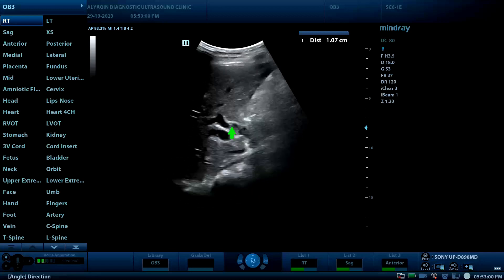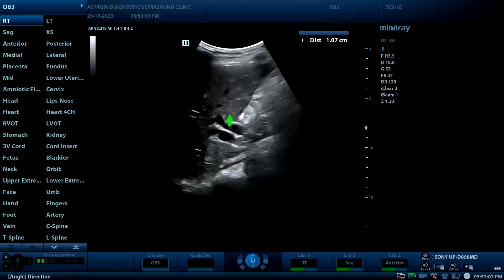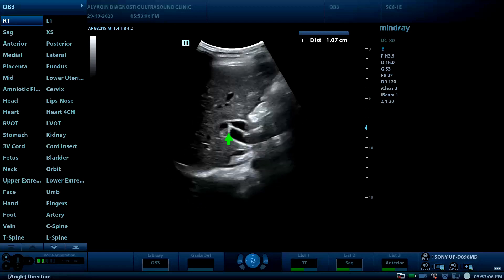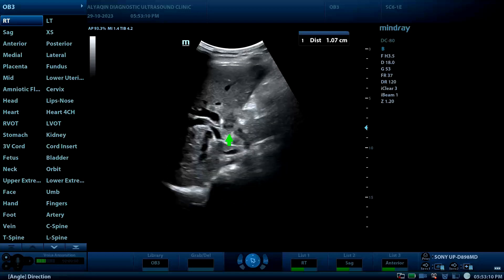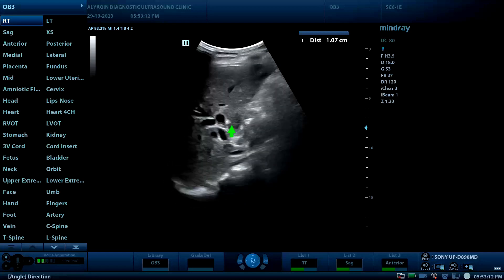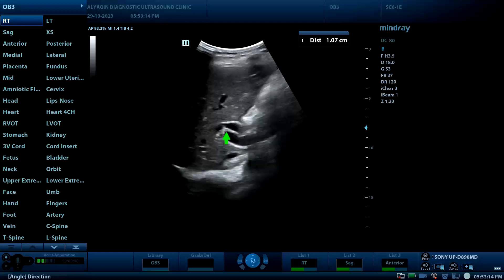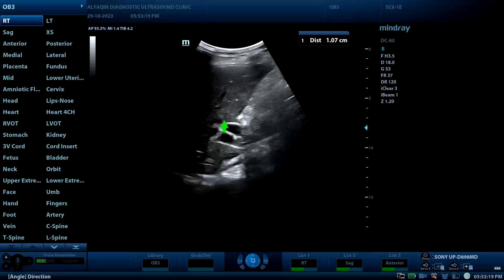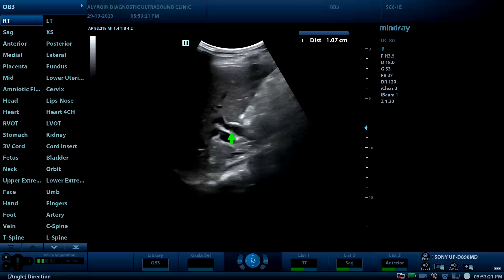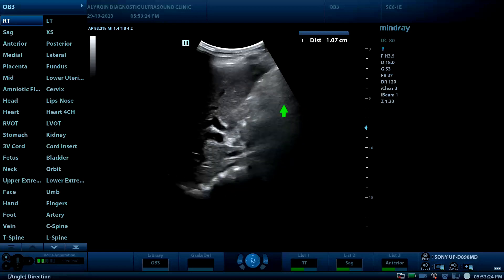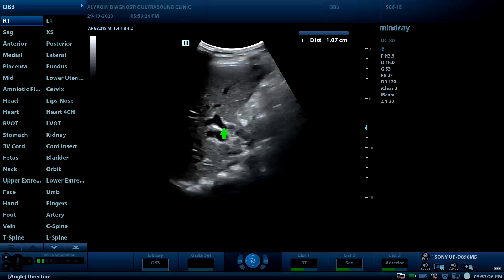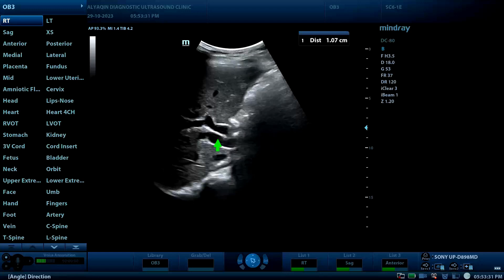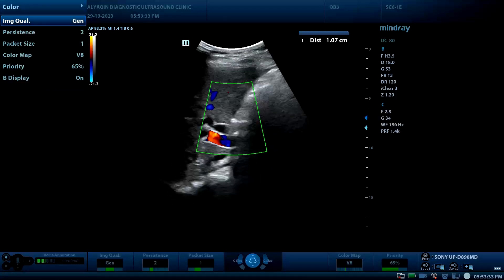Here is the portal vein, and this is the common bile duct, which is almost equal in size — which is abnormal. Normally, the common bile duct should be less than one-third of the portal vein. However, it is clearly equal in size or more, measuring about 10 millimeters, which is dilated, as seen on color view.